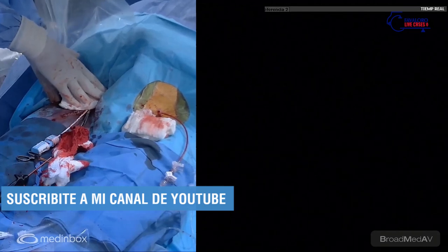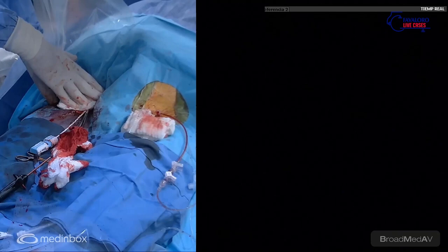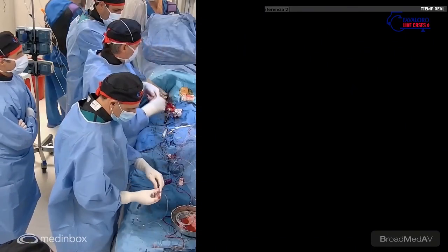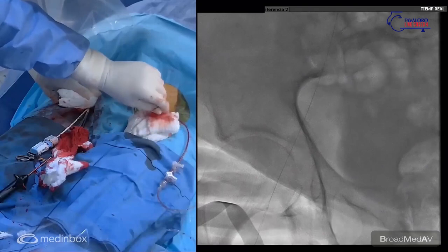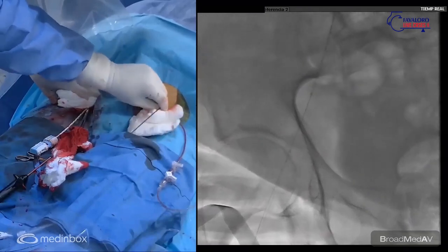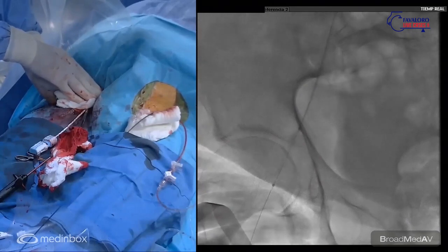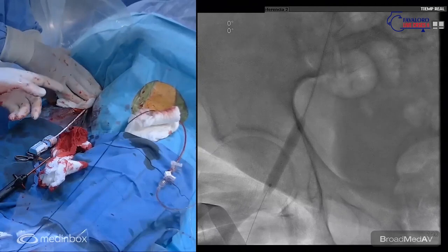But we are very happy with the procedure, with the rate of complications and how this intervention is growing. So we have improvement, but we still have bleeding. I think it is too distal from the skin due to the obesity, and that's why probably the suture is not going perfectly to the place. So we will inflate the balloon there. We'll check if we have bleeding.